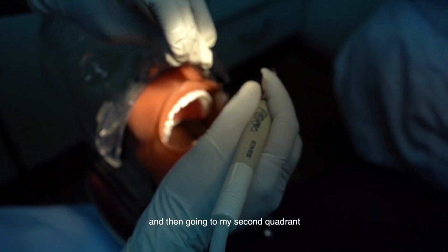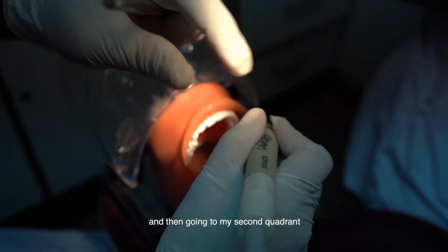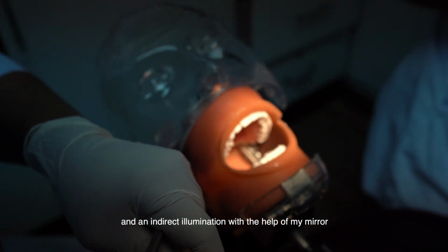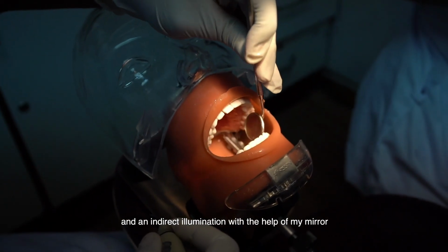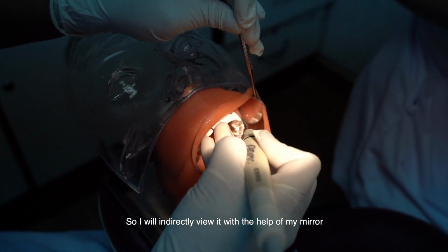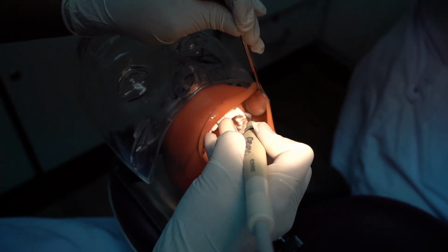And when I am going to my second quadrant, I need to have an indirect vision and an indirect illumination with the help of my mirror. So I indirectly view it with the help of my mirror.